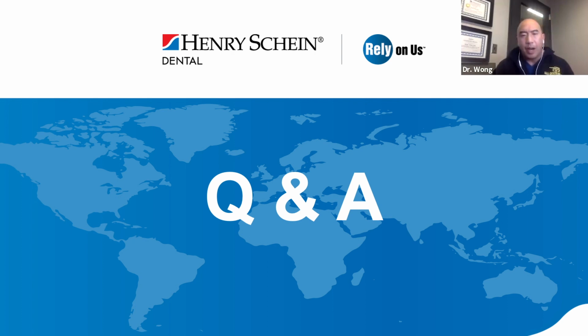For single tooth, obviously you're doing engaging. For 2 teeth, I would still say you're doing engaging. I would say when it comes to 3 teeth, if they're parallel, there's no reason to do anything but engaging. Where non-engaging comes into play, whenever I've worked with my restorative dentists, is where you don't have perfect angulation, and you have to do non-engaging.